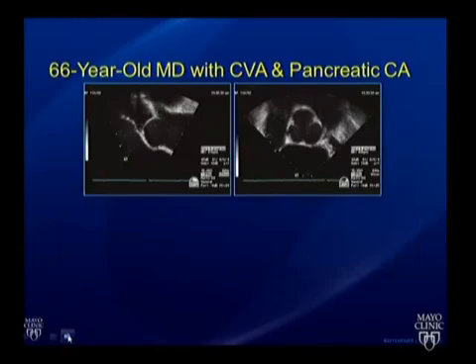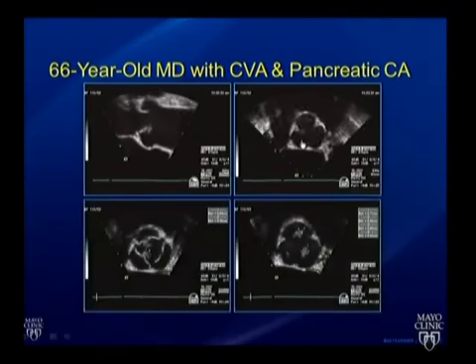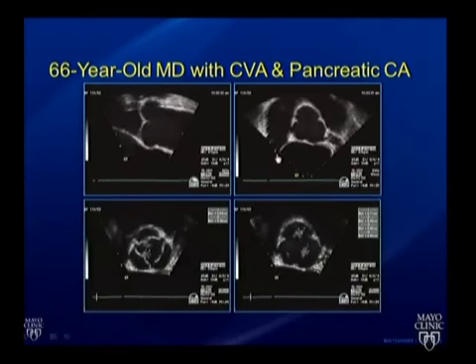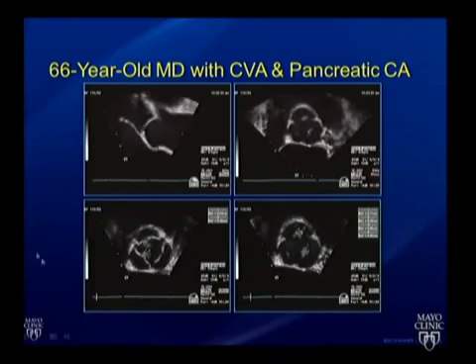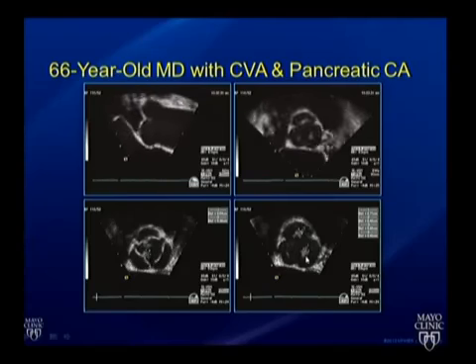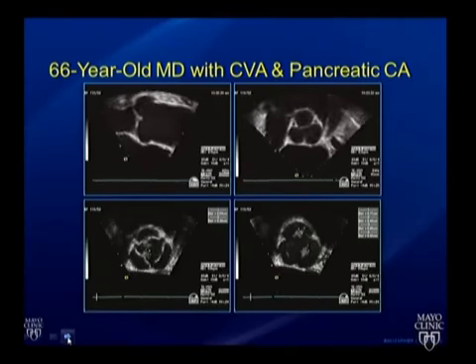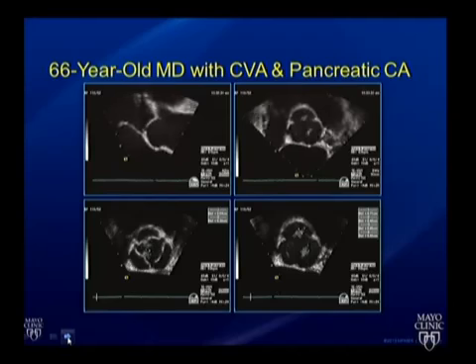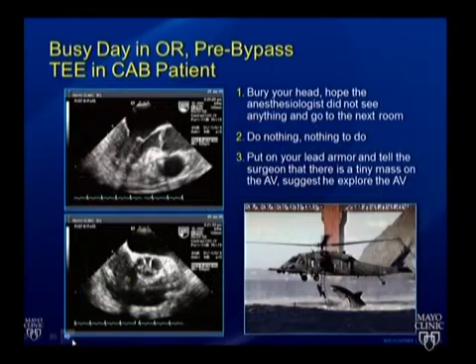Now here's a patient with pancreatic cancer who suffered a CVA. And what I'm showing you is the motion images, and if you're not careful, you'll very easily miss non-bacterial thrombotic endocarditis because they're subtle. So you can see when you do a still frame or play it in cine, each one of the cusps of the aortic valve had a small mass attached to it that was one of these highly friable thrombi that in this particular case unfortunately was associated with catastrophic strokes that kept recurring.